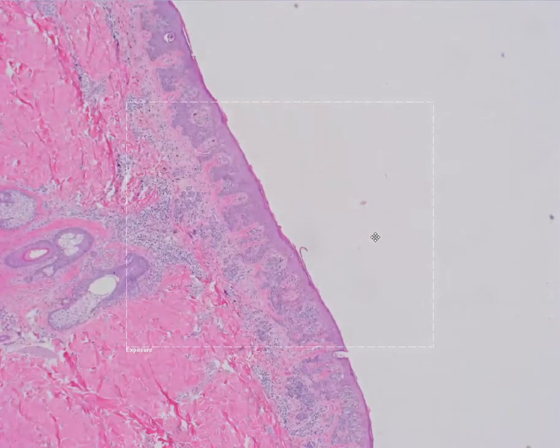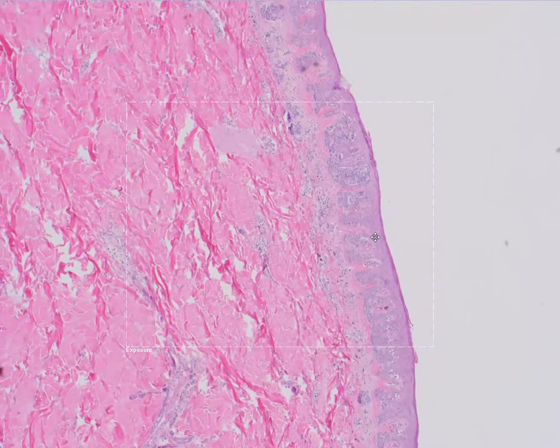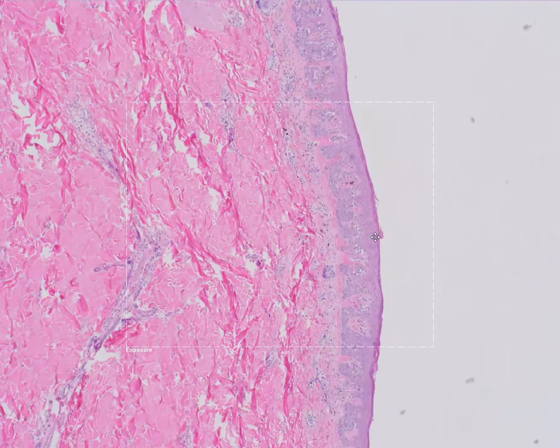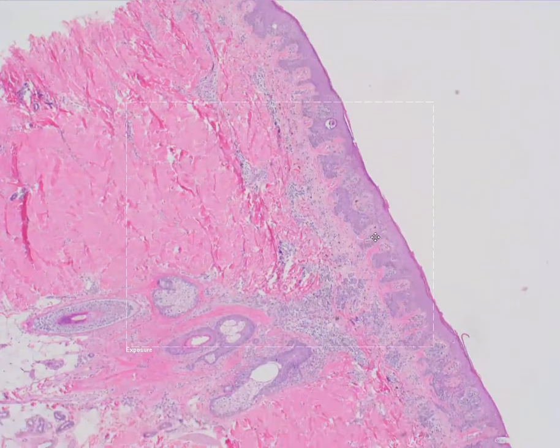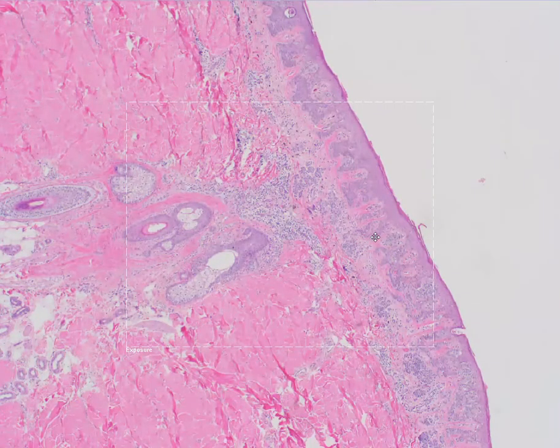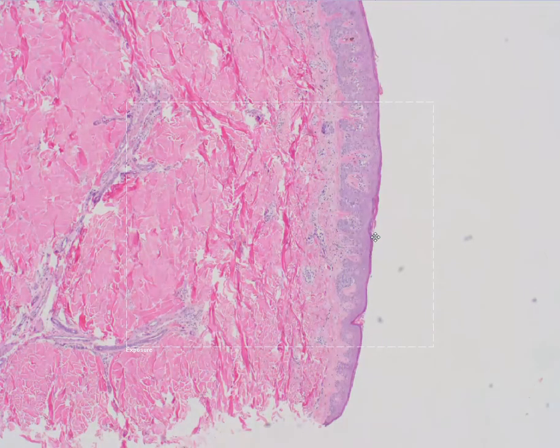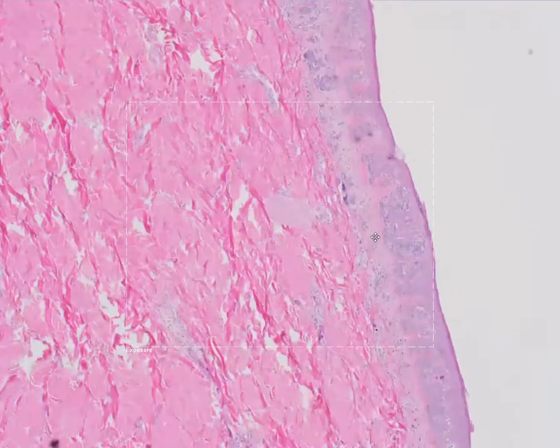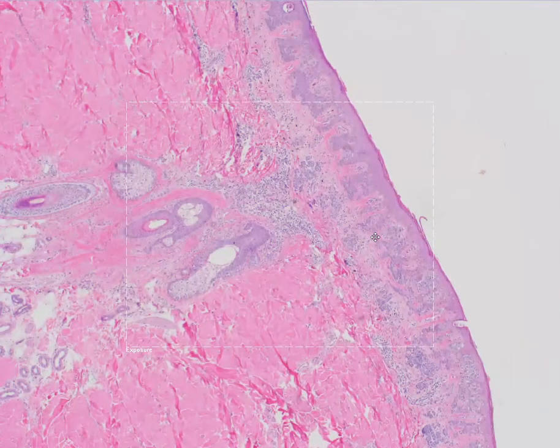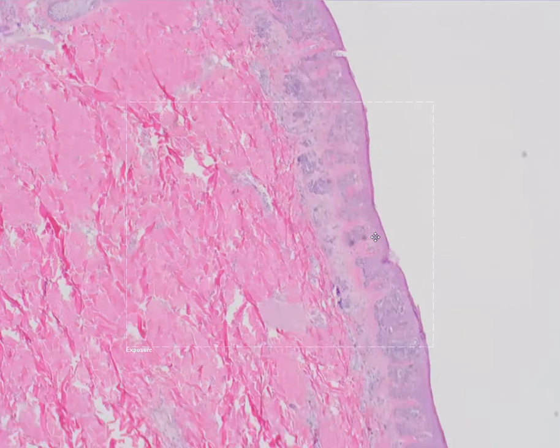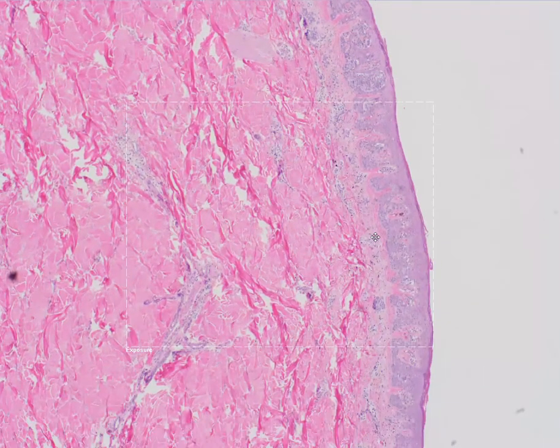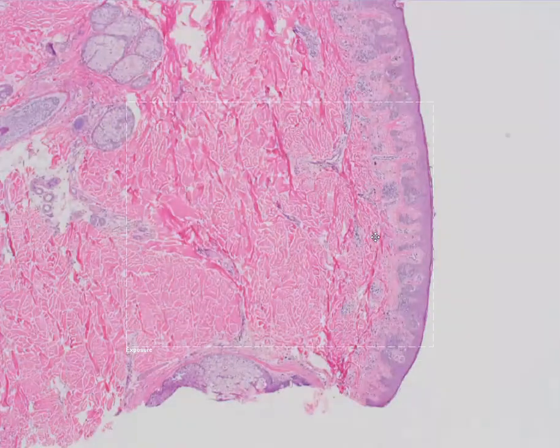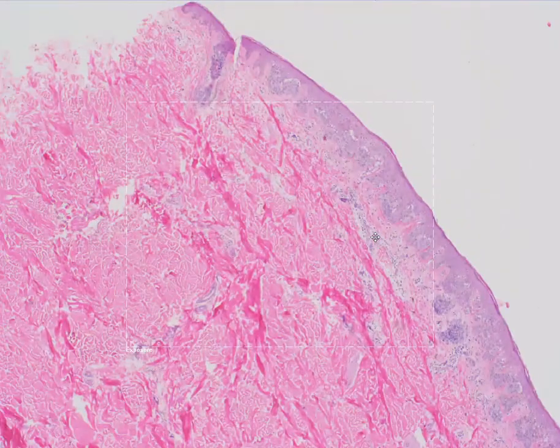Let's talk about an approach to evaluating dysplastic nevi. I usually start at low power when evaluating atypical melanocytic proliferations, trying to get a sense of symmetry. I'm looking for clear circumscription — an infiltrate in the epidermis and/or dermis that starts and stops fairly abruptly and is roughly symmetric from end to end. I'm looking at whether the nests are evenly distributed, whether inflammation is focal or uniform, and whether melanophages are clustered or uniformly distributed throughout the lesion.